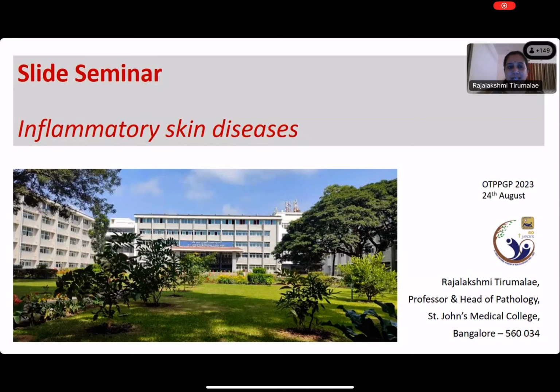There are about 15 cases that I have given. They are whole slides, which I hope all the participants have been able to see. Before we discuss the cases, I thought it's essential to dive into some of the basics of skin biopsy interpretation. So we'll just start with a brief introduction.